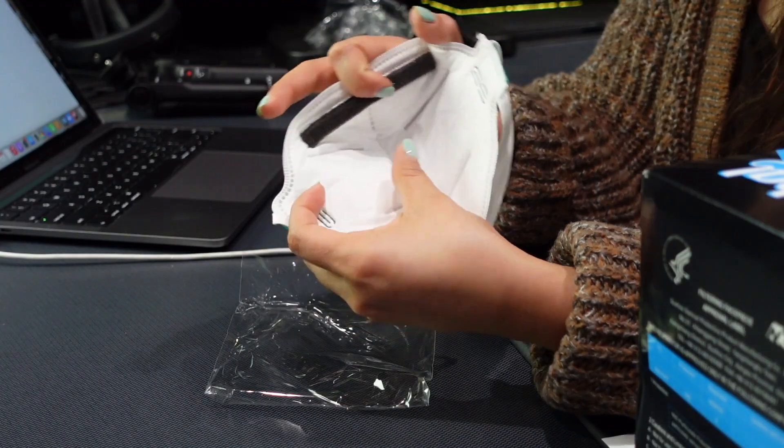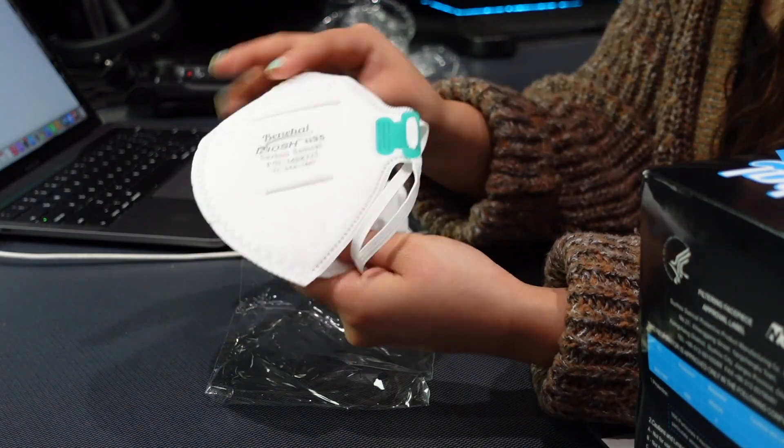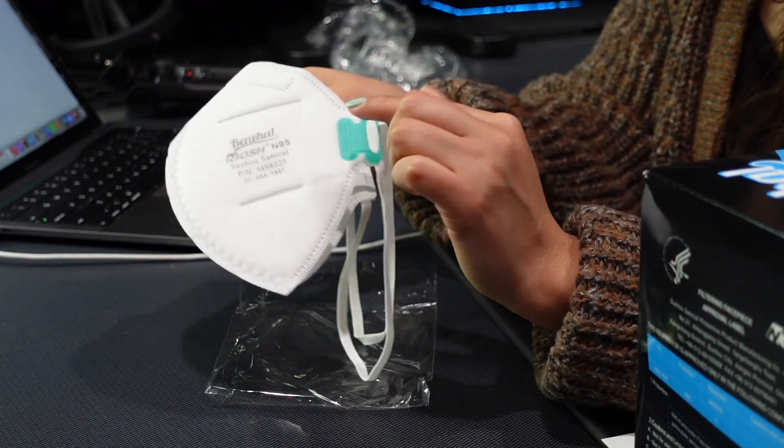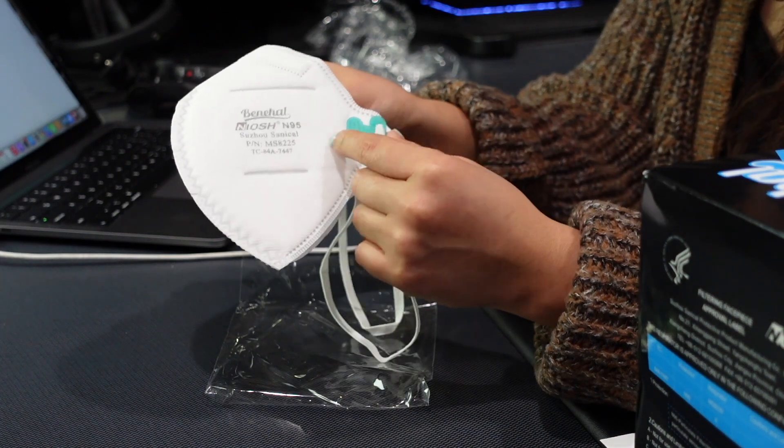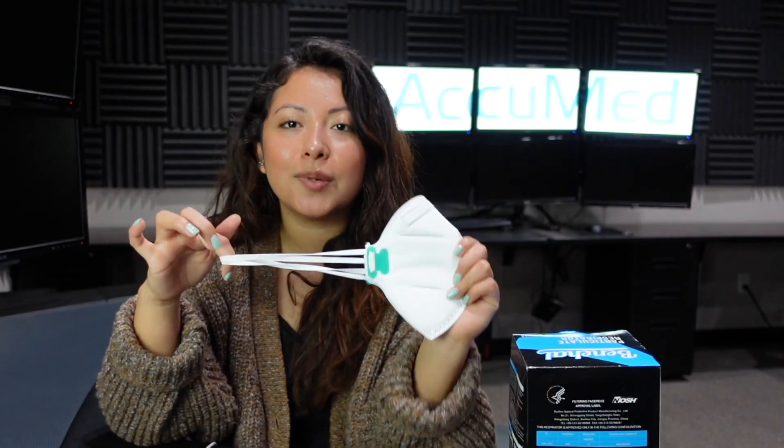From the inside, it does seem like the material is very soft. It also has this very interesting attachment — on the listing it says it's an attachment so that you can adjust the elastic better. This attachment can also help the headbands be a little more secure, because we're pulling it and it's not going to come off. Let's go ahead and put it on and see how it fits.